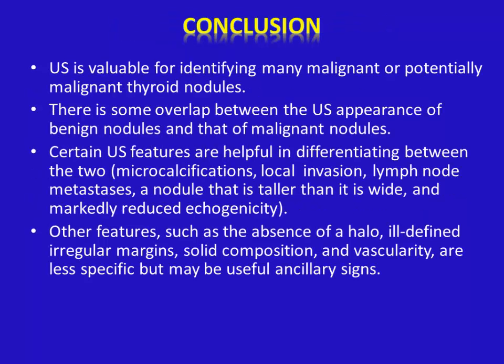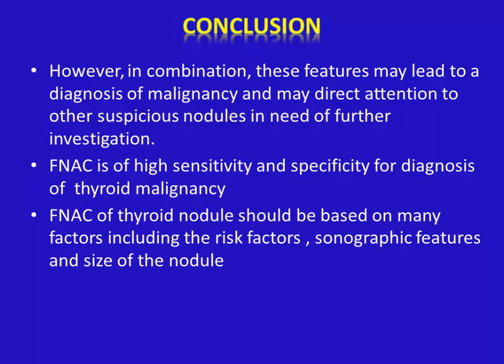To summarize, ultrasound is valuable for identifying many malignant or potentially malignant thyroid nodules, but there is some overlap between the features of benign and malignant lesions, and taking the sensitivity and specificity of each one and combining them together can give us a better idea about when to do a biopsy. FNA is highly sensitive and specific for the diagnosis of malignancy, and FNA of thyroid nodules should be based on many factors, including the risk factor, the sonographic appearance, as well as the size of the nodule. Thank you so much.